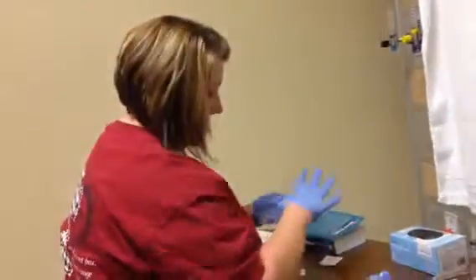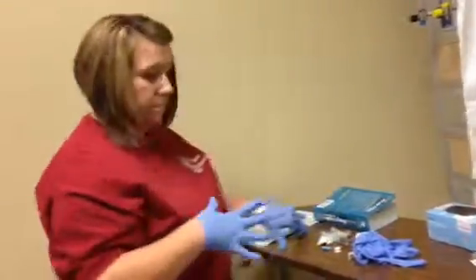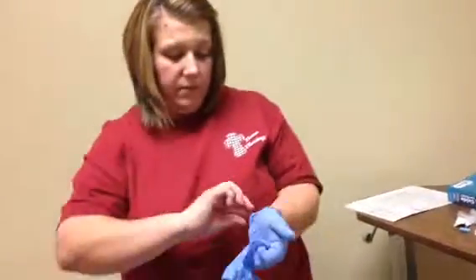Alright. I would dispose of this stuff in the sharps, clean my mess up, take my gloves off, perform my hand hygiene. I would go out and I would document on my MAR what time I gave my medication and my initials. And then you'll go back in there and check on him to see how the medication has affected him.